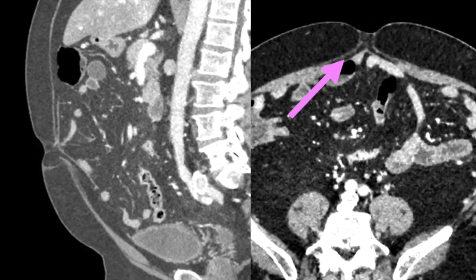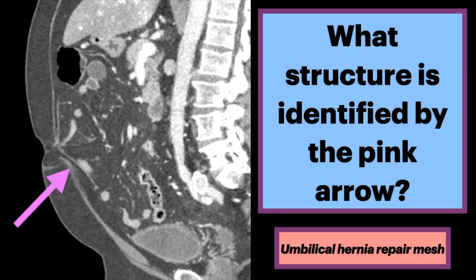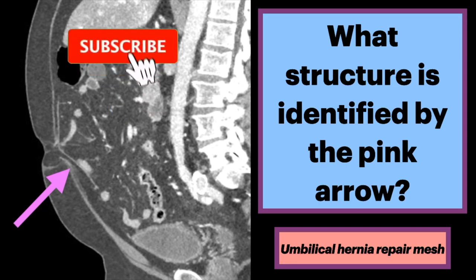Axial CT shows a similar appearance. There are no bowel loops that protrude through this defect. This patient is post-surgical. This was an umbilical hernia repair mesh.